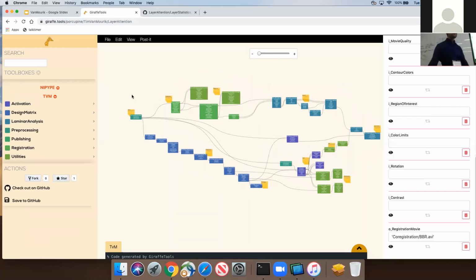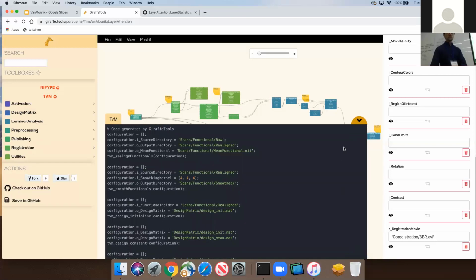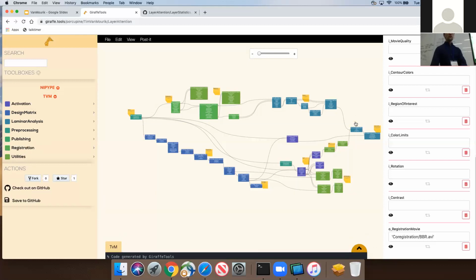Let's see. There are two things there. One is just how to adapt this application and what my workflow would be. Is that the question? Or is it more that I'm curious about what is under the hood, like what is actually happening there in MATLAB? I think it's starting in MATLAB. Right, okay, that's a good question.